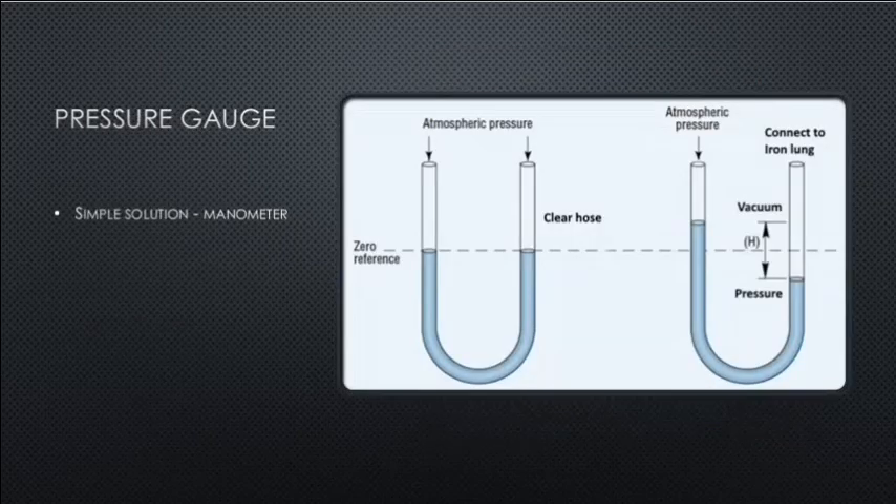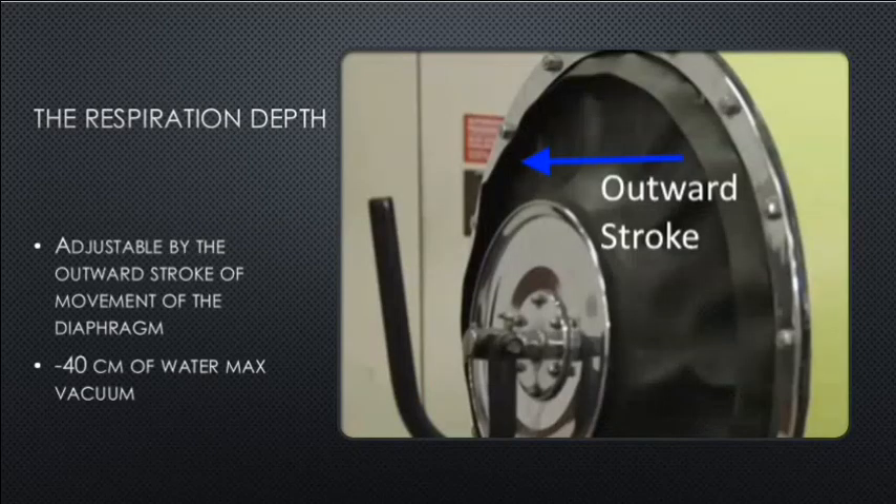Pressure gauge is a simple manometer using clear hose and water to determine pressure and vacuum in the iron lung. Respiration depth is adjusted by the outward stroke of the diaphragm — how far we pull determines how much vacuum we make, measured in centimeters of water.